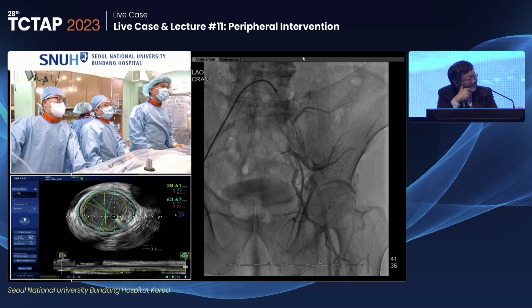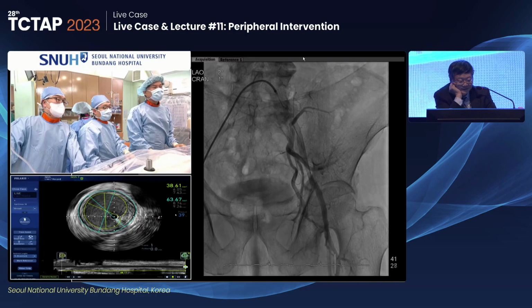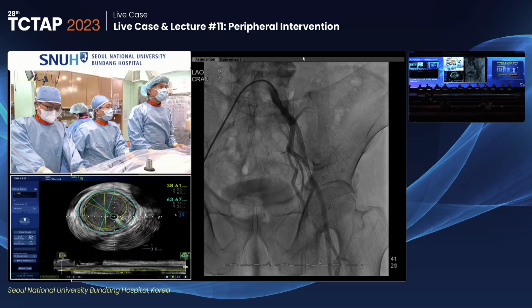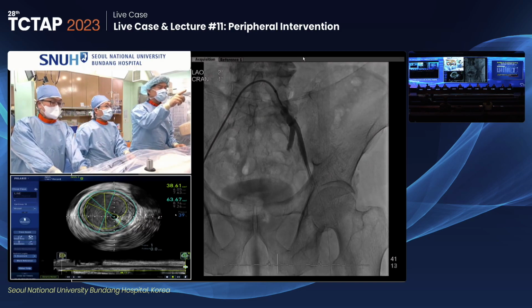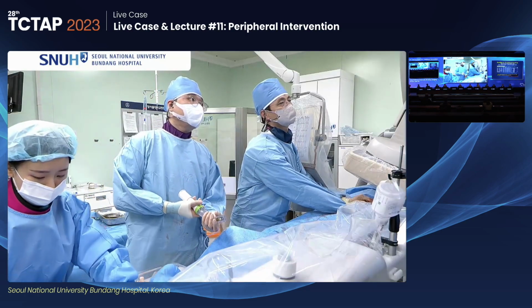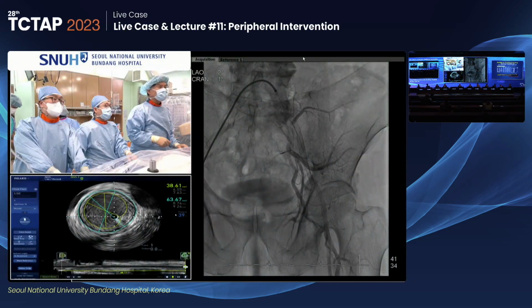Dr. Actually, frankly speaking, let me see without RAU. IVUS, let me see RAU quarter view. Once more. Dr. Ra, we're going to switch over to room 1 real quick, and we'll be back with you in just a few seconds, okay? Yeah, because let me comment finally, if I have not done the IVUS, I will not do additional studies.